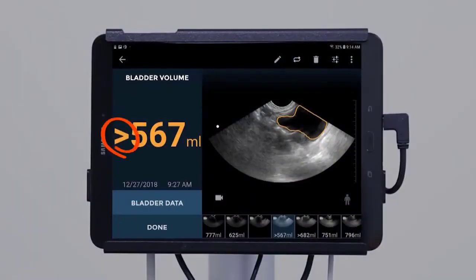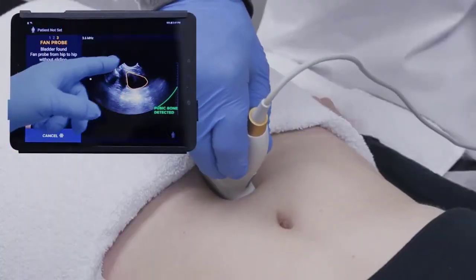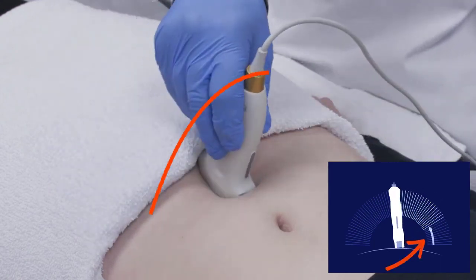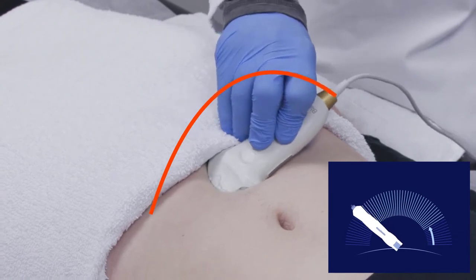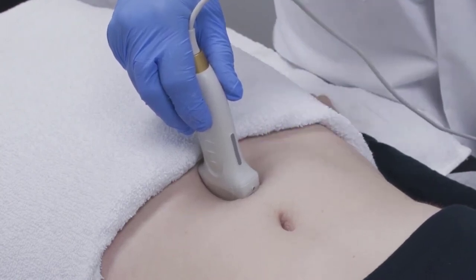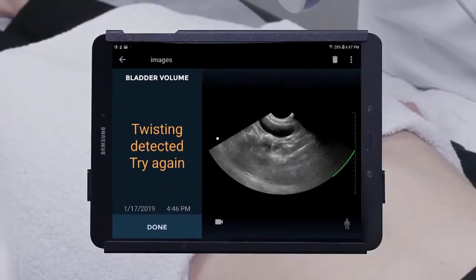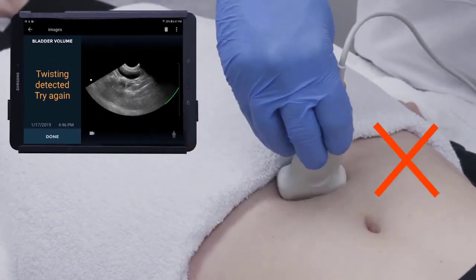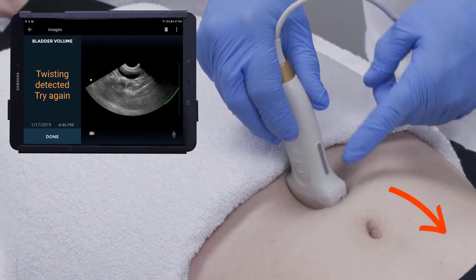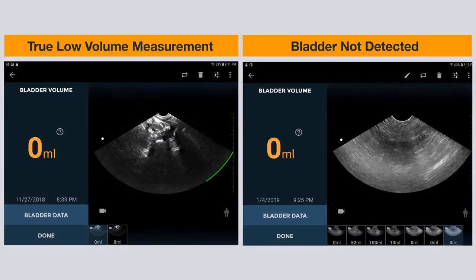If the greater-than symbol appears along with the volume measurement, there are some actions that can be helpful. Make sure the bladder is centered on the screen and that you are fanning the probe towards one hip until the sound indicator is heard and an arrow is seen, then fan back towards the other hip until a second sound is heard to capture the entire bladder. Anchor the probe to ensure it does not slide in any direction while fanning. If the phrase 'twisting is detected' appears, re-scan taking care not to rotate the probe during the fanning motion, making sure the orientation marker remains pointing towards the patient's head. Note: a true low volume bladder scan will present with a clear pubic bone indicator and a clear visualization of a small empty bladder on the screen.